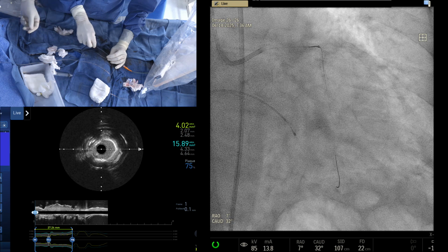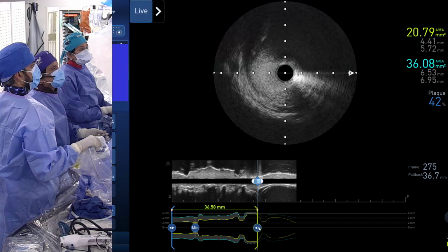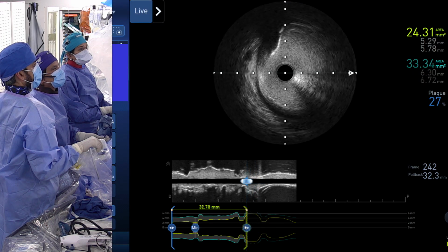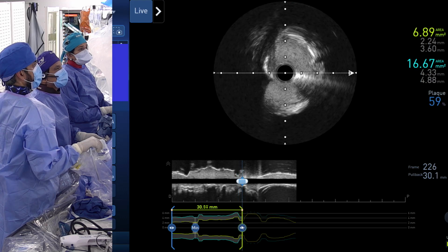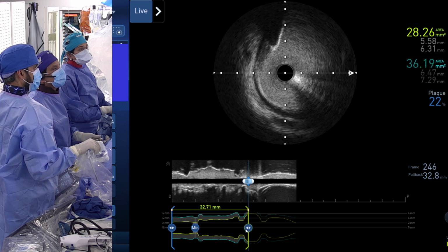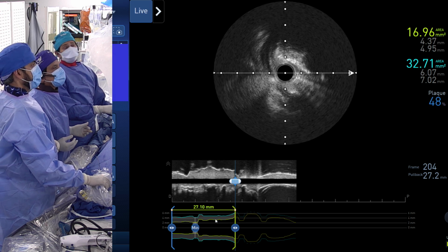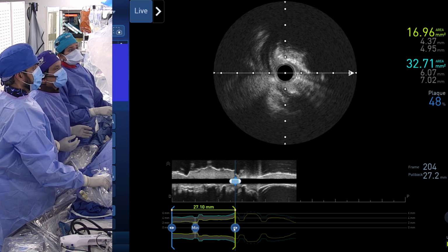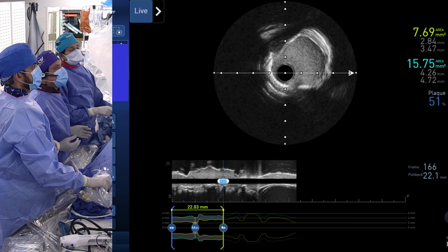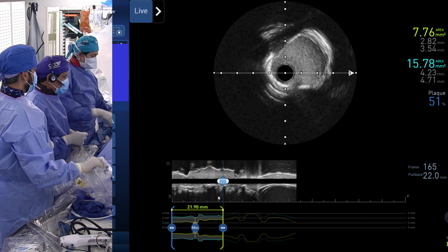Yeah, come. No, don't go that fast. You're in the guide. Go distal. Keep coming. Now move the cursor. Yeah, slow. Right there. A little bit more. The ostium does not have ring calcium. Go distal, below the ostium, right there. There is a ring calcium. Come a little proximal. In the LAD, there is a ring calcium. Come back distal, keep coming slowly. So this is the LAD itself, but the lumen is large, even though there is 360-degree calcium. You see that?